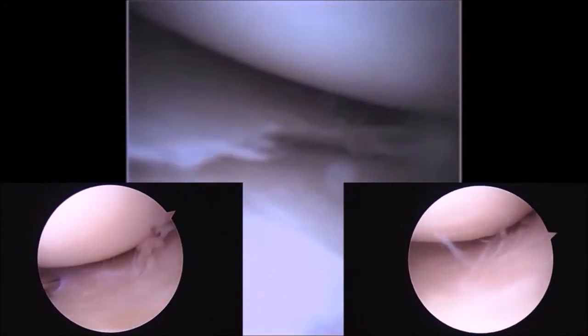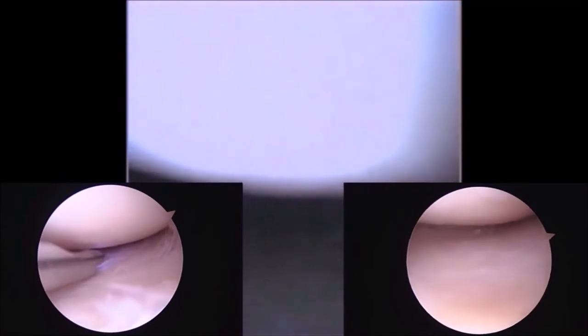We then switch to the medial compartment. In the bottom left inset, we can see the MyEye under direct visualization with a traditional arthroscope working the medial compartment.